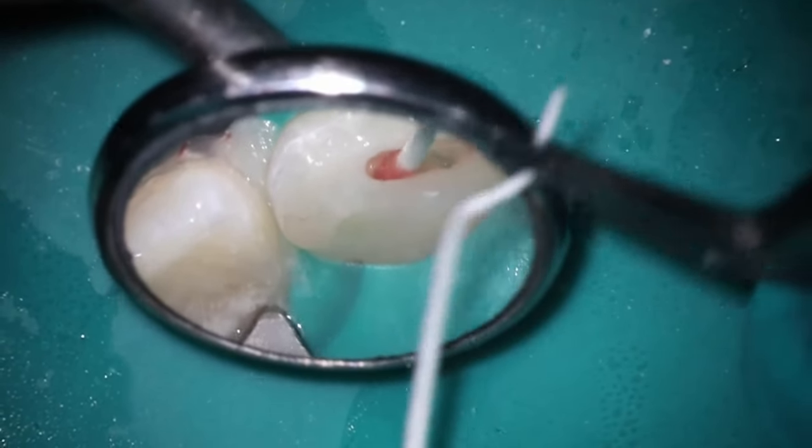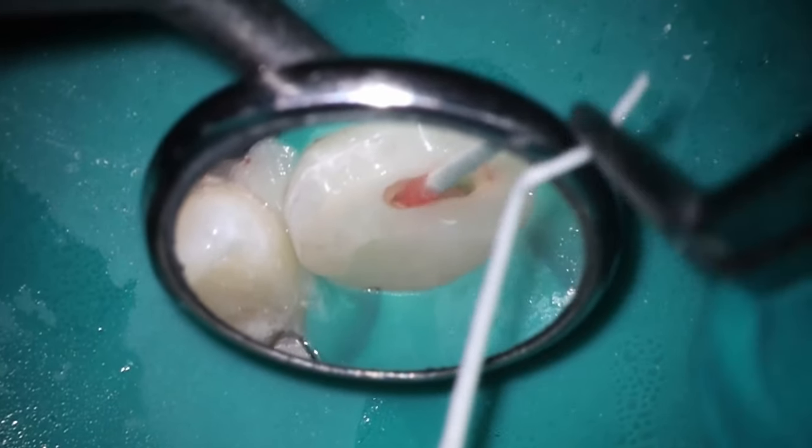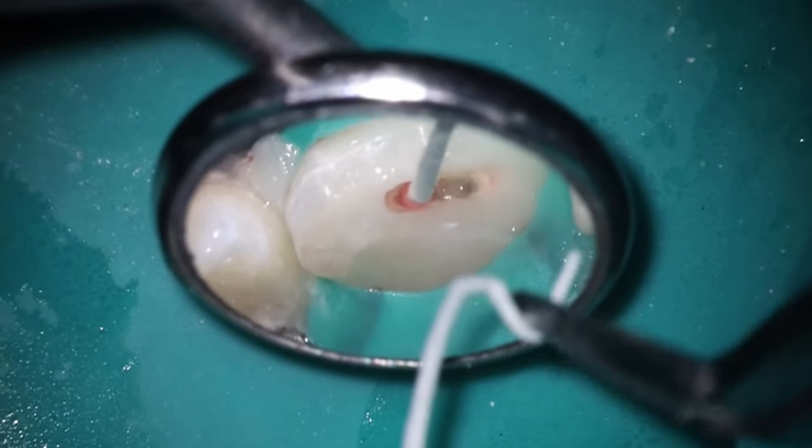You can see what I was talking about. The tissue isn't quite as solid as it would be normally. So I'm just using the back end of a paper point to help make sure we compact everything down. I did a few more of these. I decided to cut it because you kind of get the concept.